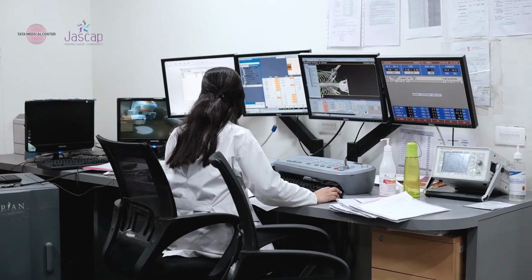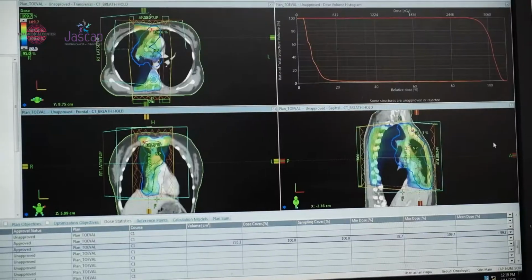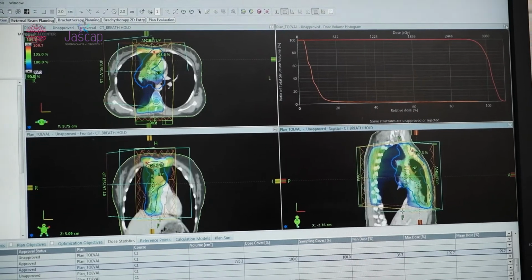The entire process after injecting contrast to acquisition of something that we call the radiation therapy planning scan takes about 7 to 10 minutes. Although we request an appointment time of an hour so that you are mentally prepared for some delay, if any, from our services. Once the radiation therapy planning scans are acquired, while you are on the couch, our radiographers will be checking whether all images are correct and exporting those images, electronically of course, into something that's called the radiation therapy planning system. Only after image evaluation and checks are complete would you be given the freedom to go home and do something that you would want to do to relax for the day.